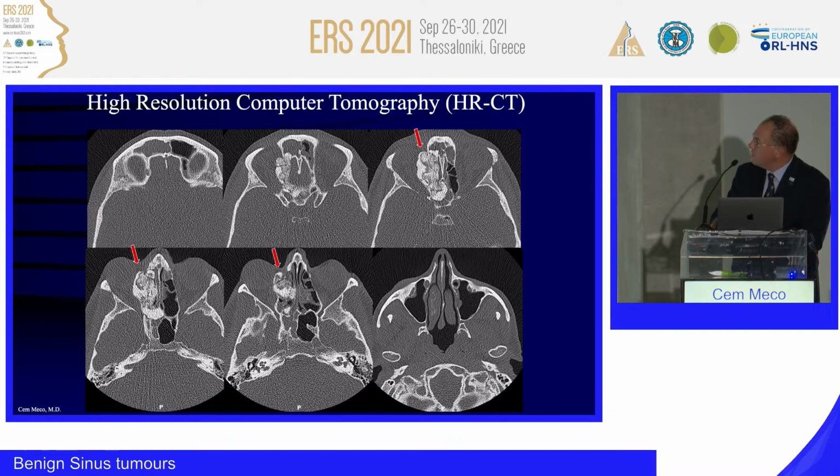So that was the MRI, because we wanted to see what's happening in the orbit. So these were the MRIs, and clearly you see the frontal sinus is obstructed, as well as the sphenoid sinus at the back. And the periorbita was probably intact, and generally it is intact. It pushes in. So this was the osteoma of the sinonasal cavity, with compression on the globe, the medial rectus muscle, and at the back the optic nerve, as well as causing the cosmetic problem due to proptosis, apart from the drainage obstruction problems.